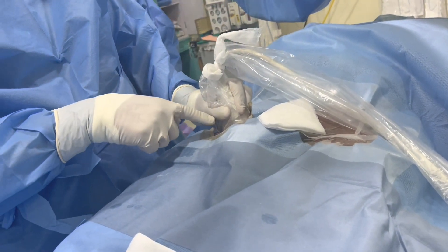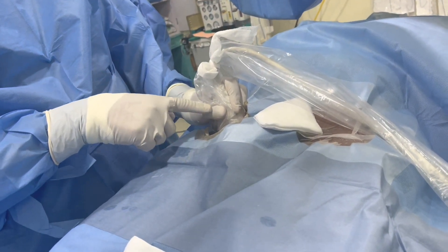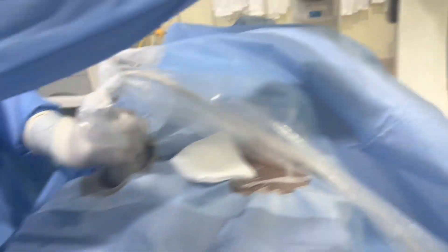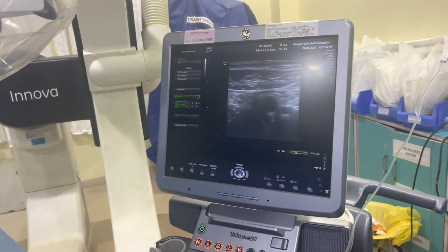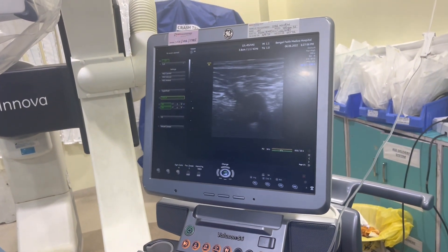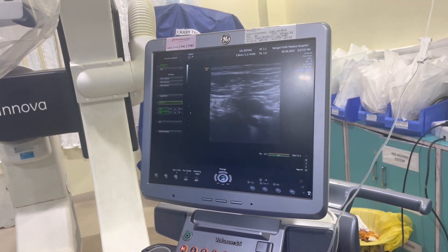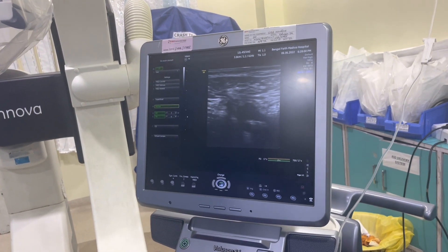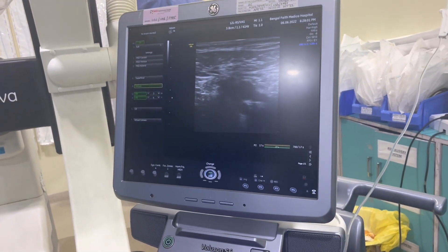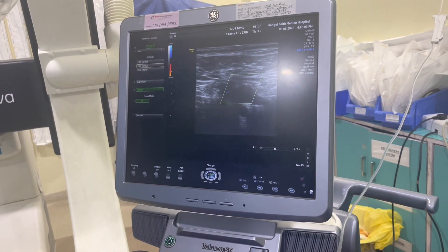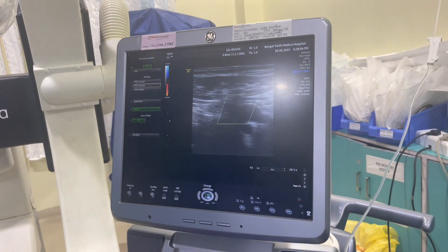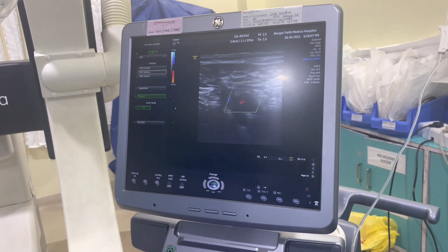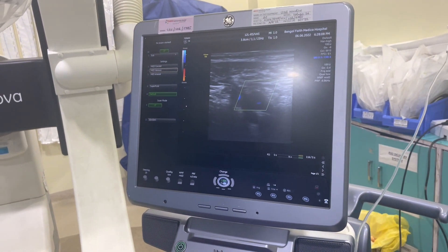Now you see the probe position and how we keep it. It is cross-sectional and you can appreciate here the bifurcation. This is the bifurcation of the femoral artery. You can appreciate here. And give a color flow — see, if you just push and you can see how pulsatile flow is there. And again push, remove.